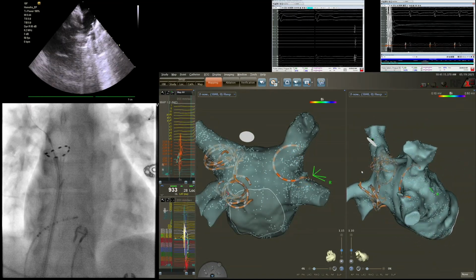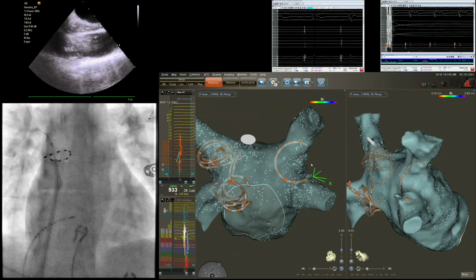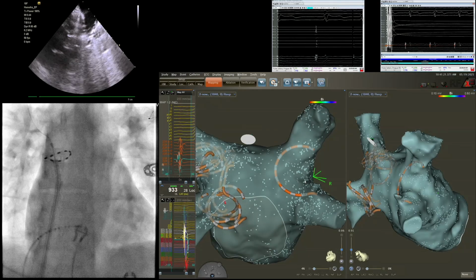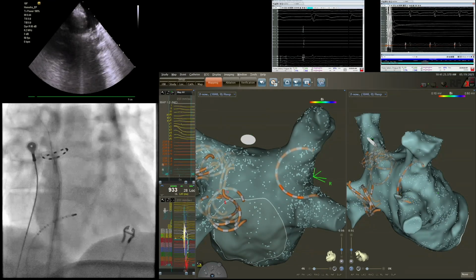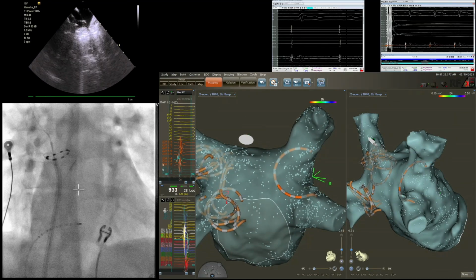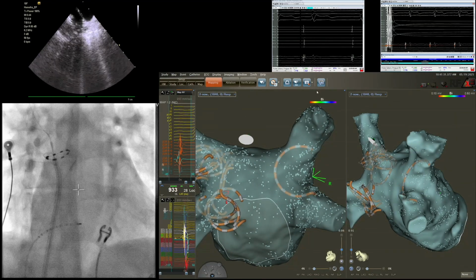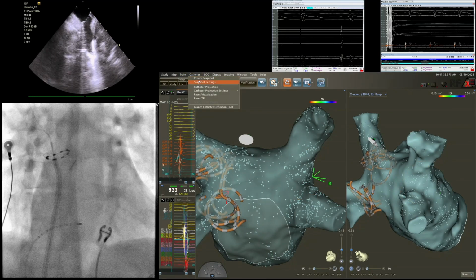I'm not able to go too much more. Okay, and this, can I do this? So we are a little bit opening, but I will survive. So we will try. Let's go for a bigger vein, and we can cover the carina.